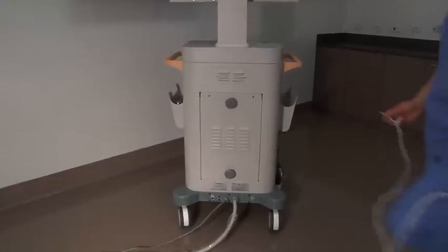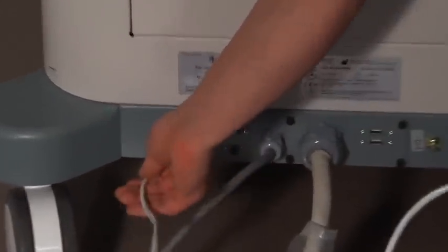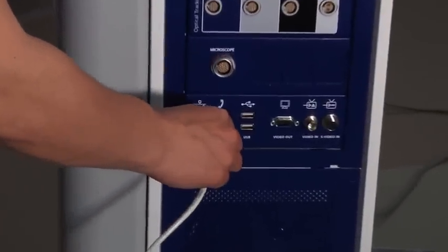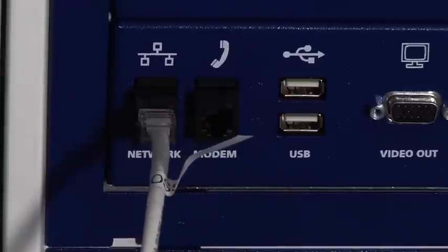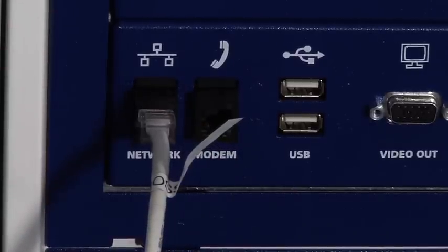If you're using the OARM system with a STEL station navigation system, you have one more connection to make. Plug a network cable into the network port at the back lower connection panel on the MVS. Plug the other end into the network port on the STEL station staff cart. Give the cable a light tug to make sure it is secure. Your system is now ready for imaging.